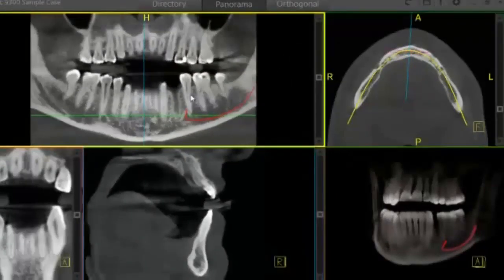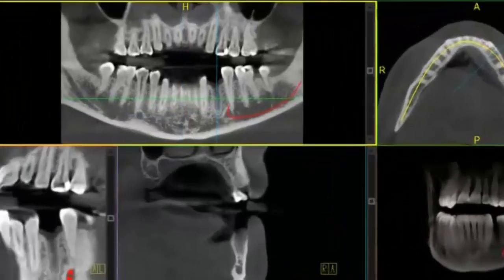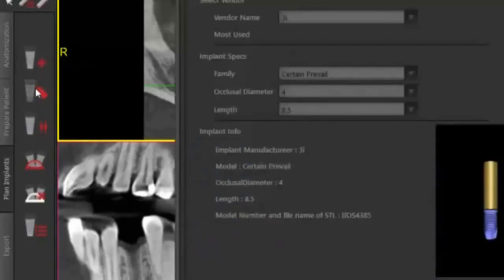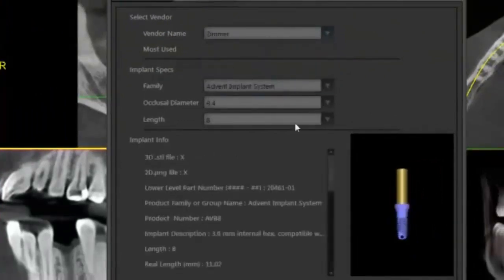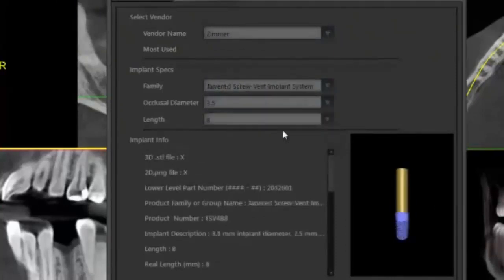I'll begin by clicking on our edentula site and move down to the Plan Implant tab. We've got a couple of libraries to choose from — a generic library, or for this case I'm going to use a Zimmer implant, so I'll go to all my implant libraries, go to vendor name, and drop down to Zimmer. I'll use the tapered screw vent implant for this case.